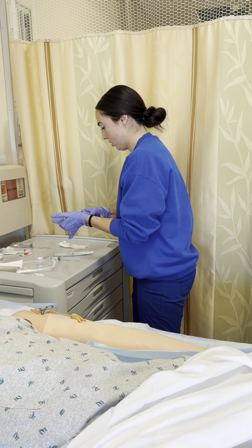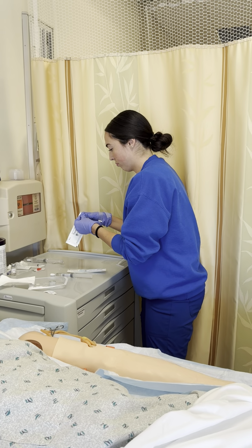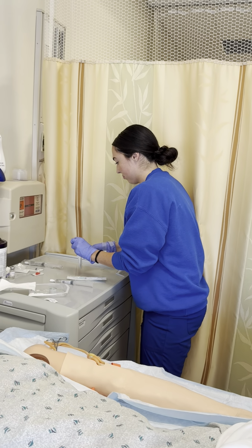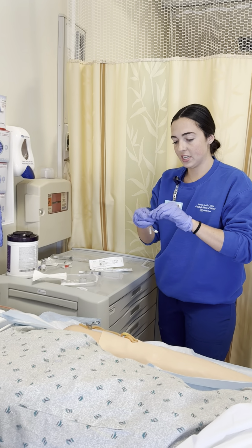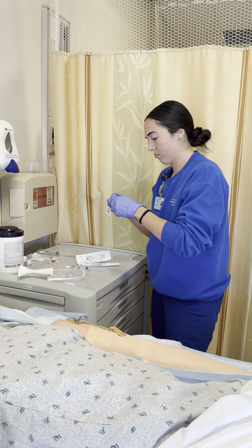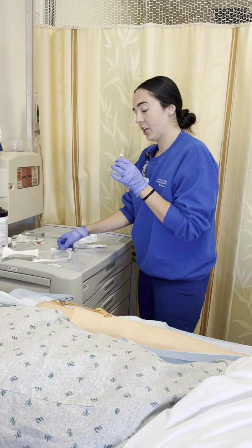Okay. Now I'm going to open up my J-loop. I'm going to open up this end cap here. Make sure it's loosened, and I'm going to prime this.